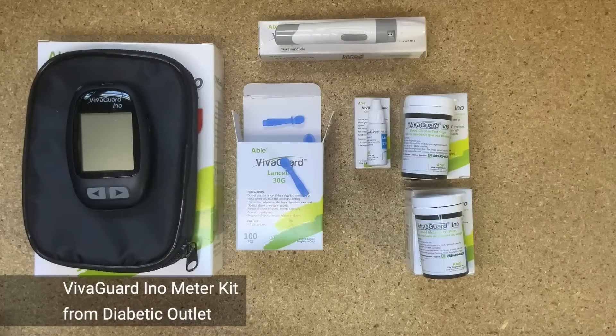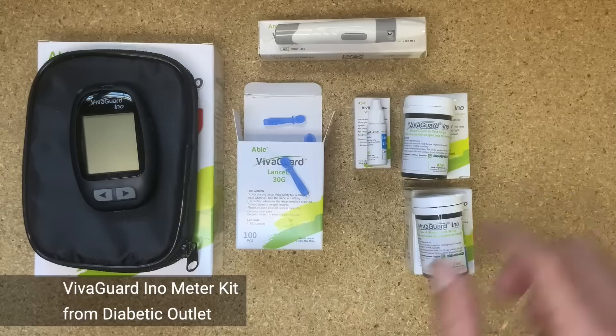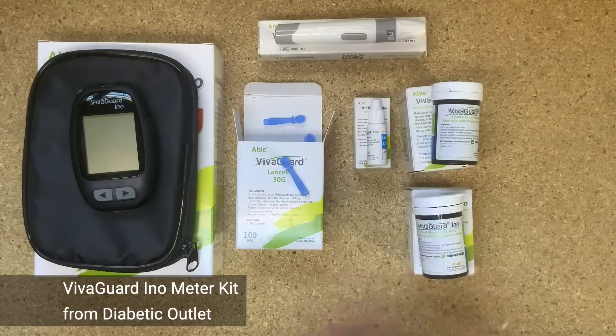So what we've got here is the blood glucose meter, the lancing device, 100 lancets, 100 test strips — 50 in each box — and control solution.